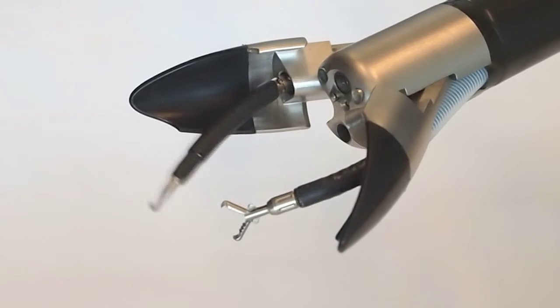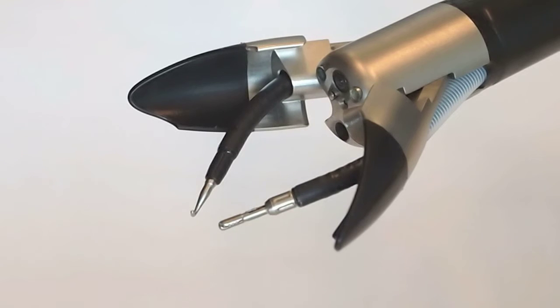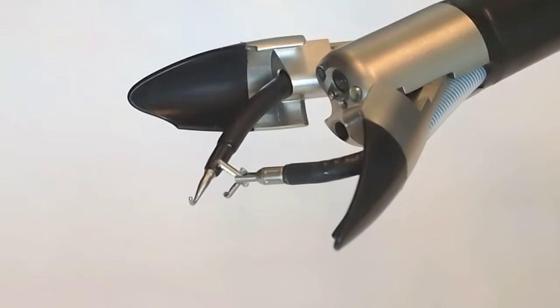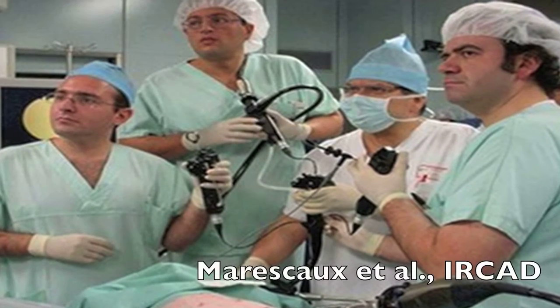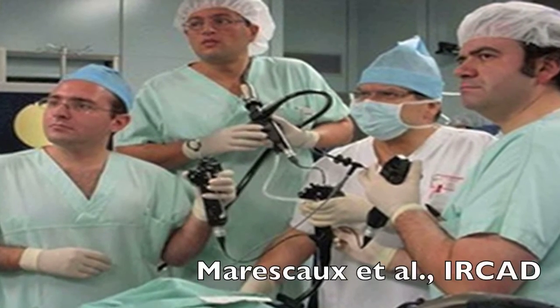Recently, advanced endoscopes have been developed that not only allow the physician to examine the patient, but also enable performing interventions, such as removing malignant tissue. The endoscope is equipped with multiple instruments, which have multiple degrees of freedom. Marescaux and his colleagues have used the Karl Storz Anubis endoscope to perform interventions.